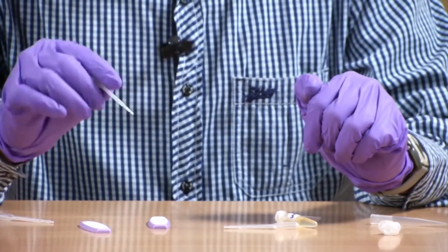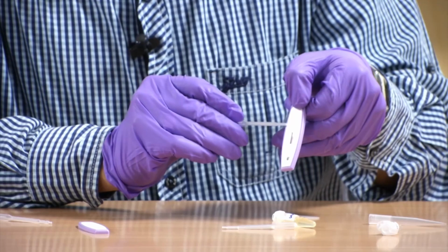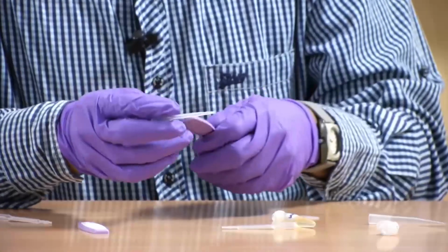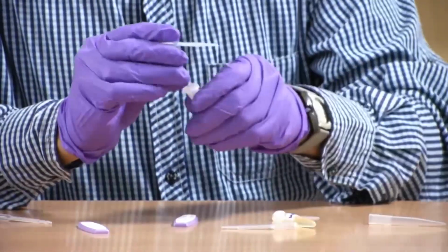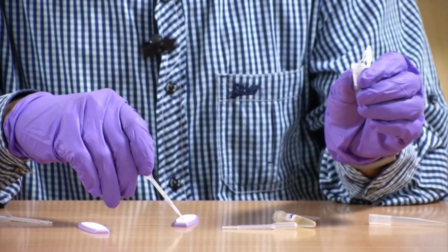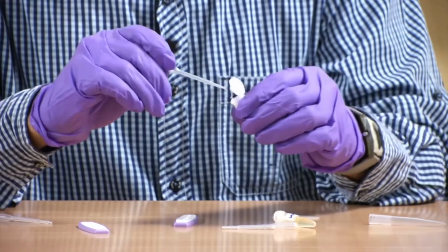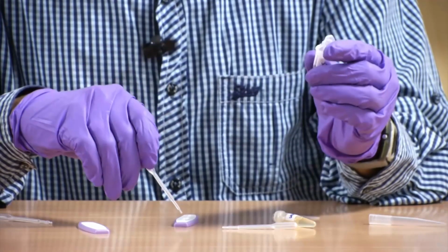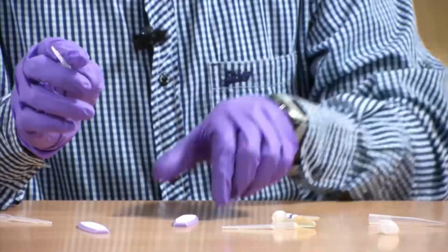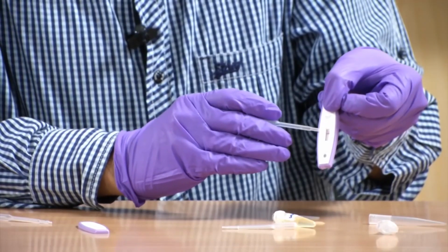So, you will get only one line, only in the control. You can see here, C is the control and T is the test line. You can see the formation of a color line, only in the control; you are getting this line only there.